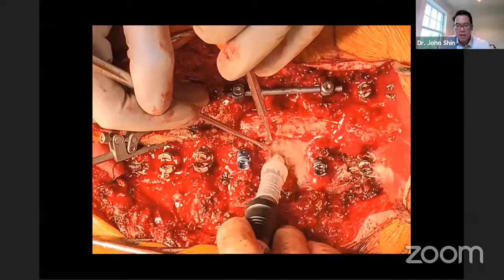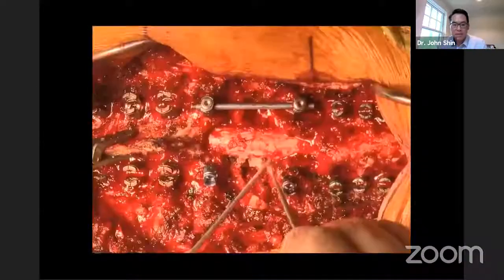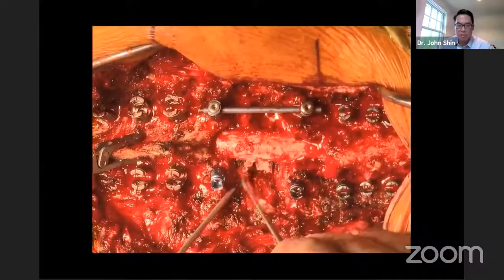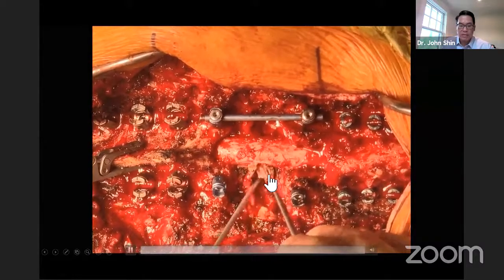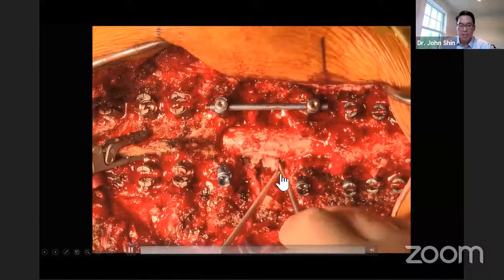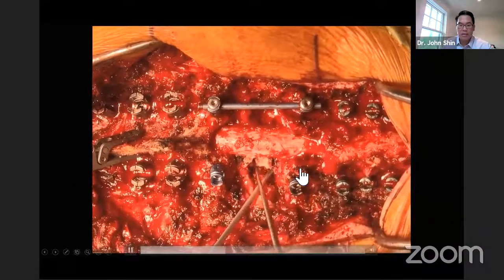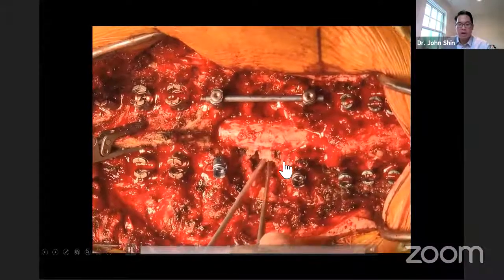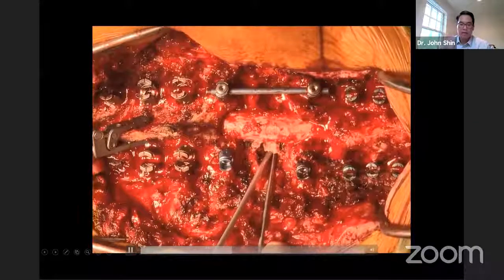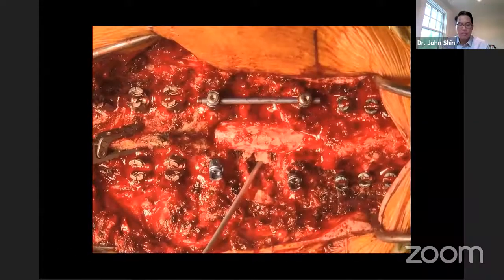You can see when that bone scalpel just kind of gives way a little bit. And that can be very helpful. And again, we can see that we've made cuts on both sides. You have the nerve roots there. We mobilize the thecal sac. And I'm basically showing, we can see how loose it is now. You can see that I'm moving it side to side and it's pretty loose, okay? So we freed it up above, below, laterally. I use navigation to check that anterior border. I know I didn't break through.